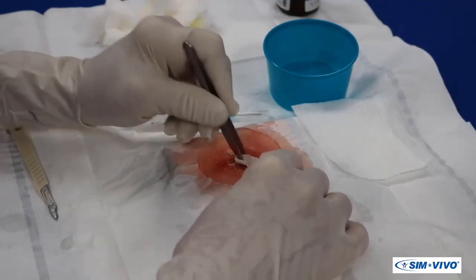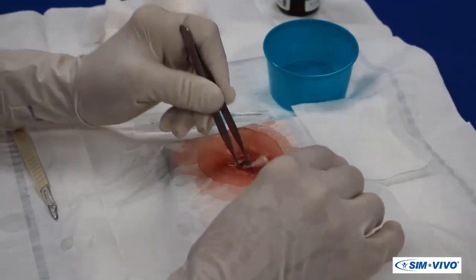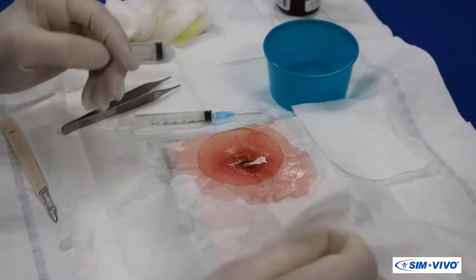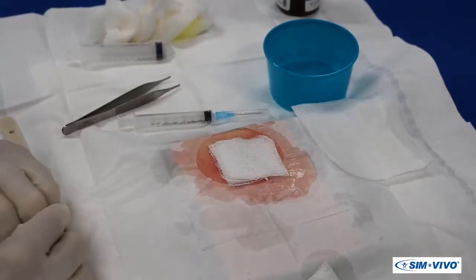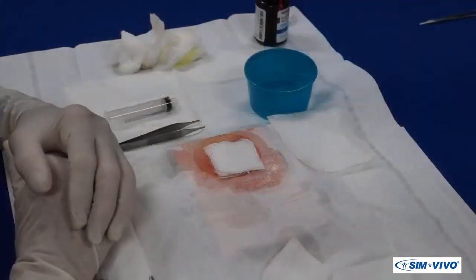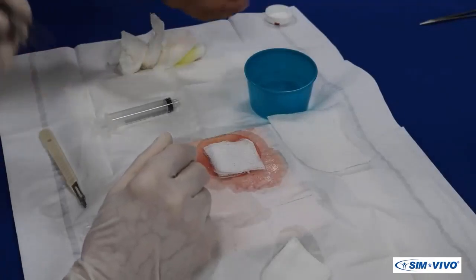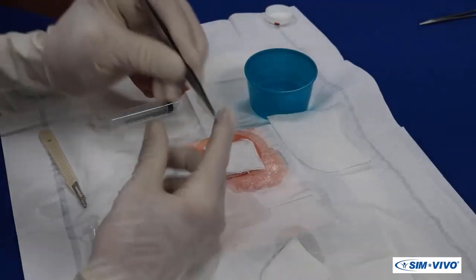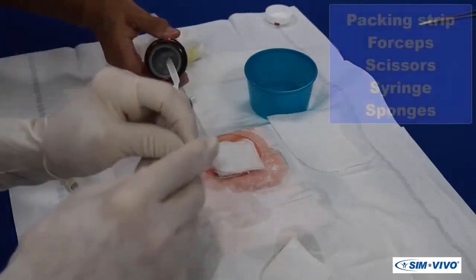If only part of the packing is placed in the cavity, cut the excess to leave a short section on the skin for later removal. Place a small dressing over the wound, which will be taped in place.